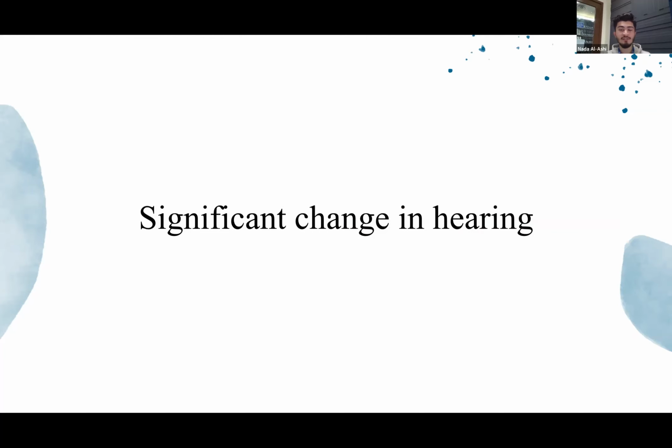This is a significant change in hearing. For example, you have a patient whose hearing test you did last year, and they're back again for an annual hearing test. The one thing we want to look for when we get their new result is to check, has there been a change? And if there has been, how much? And whether this is significant or not.